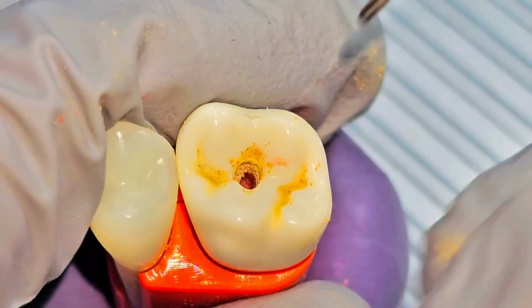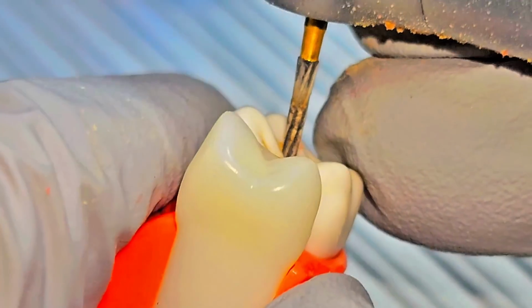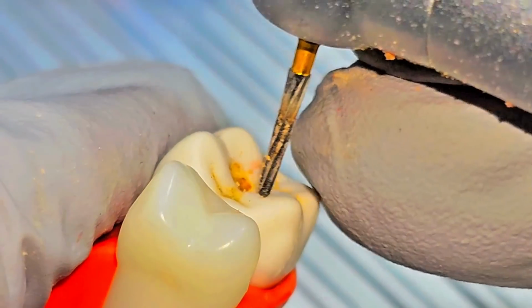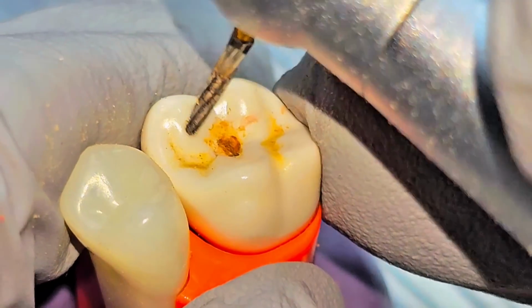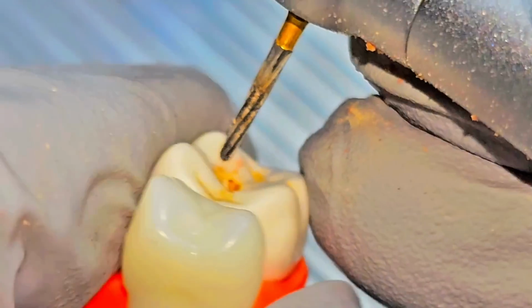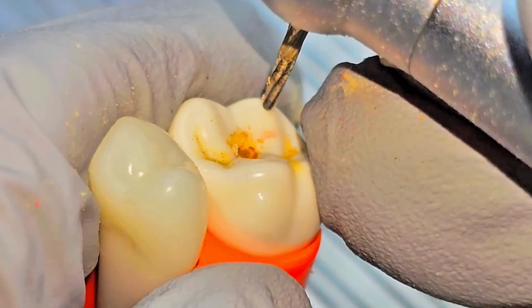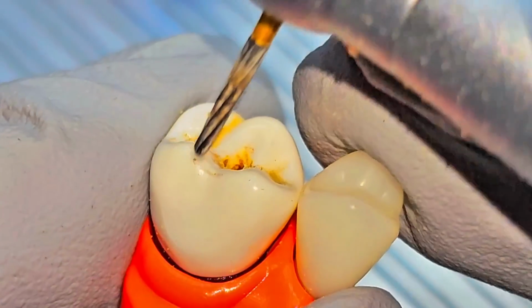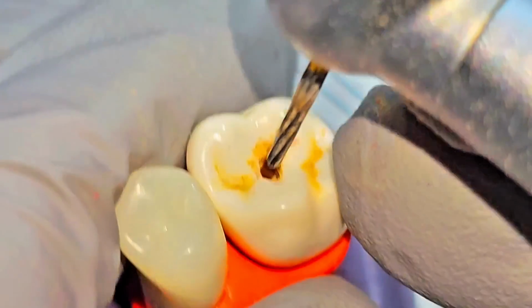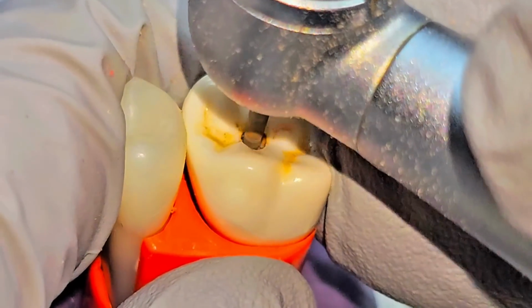Whenever I work on the parallel area, I incline my burr like this when I push this wall, so that it is safer. And when I work on this, I incline my burr towards the cusp tip, so that I can prevent making it too flared.